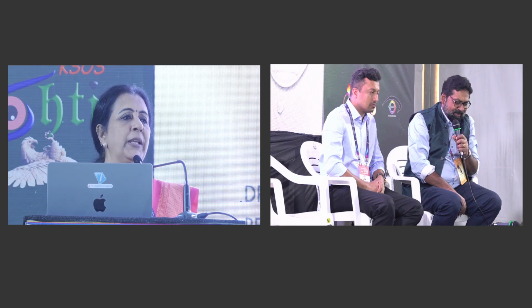It's not that if you presume even the grade 1, we treat it as a PPC and don't do a hydrodissection, it's okay. It's all right. It's just that the surgery can go faster because you're overcautious in a case where we need not be.